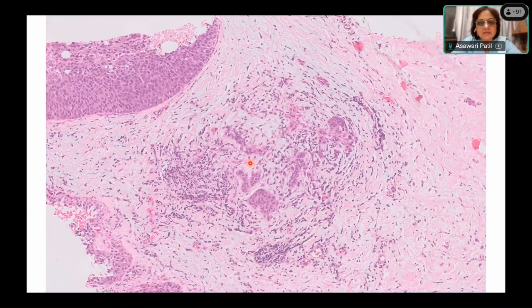Anyone else want to say something? Harshita, Sarita, Anthony. Ma'am, normally a myoepithelial cell will be flattened or epithelioid. Sometimes they can have a clear cytoplasm as well. Exactly. So basically, when you have these distended ducts, then you will see the myoepithelial cells are flattened. But if you see normal breast parenchyma, many times they have an epithelioid appearance with more clear cytoplasm, right?